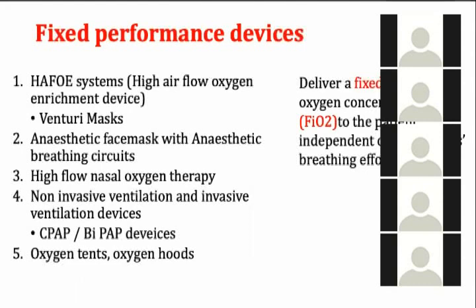Any questions on variable performance devices? Okay. Excuse me, madam. Yeah. Even something like nasal prongs, they deliver oxygen at a certain rate, but how would it vary according to the patient's respiratory rate? Because anyway it delivers at a constant rate, madam. Yeah, when we talk about variable performance devices, it is not only the rate that we are talking about. It is the patient's effort and some device factors as well. If I explain it, it is going to take a bit of time.